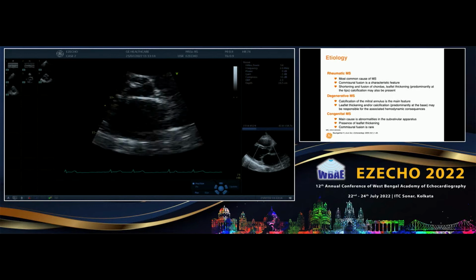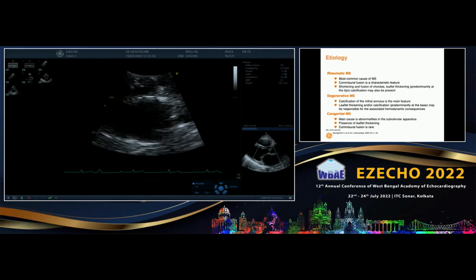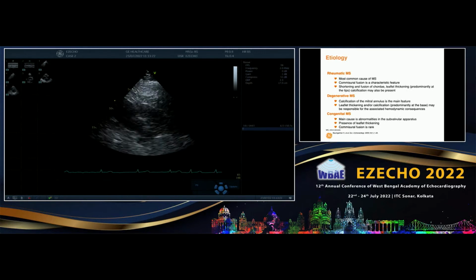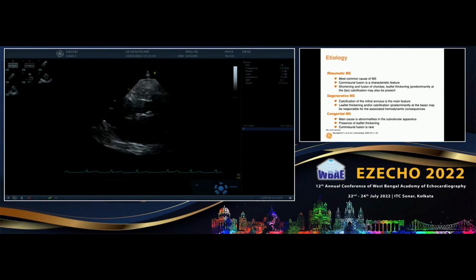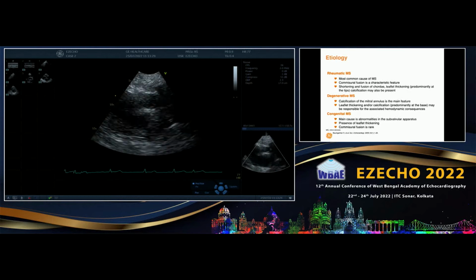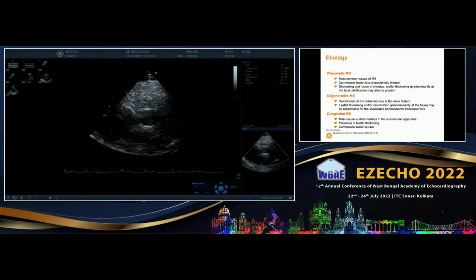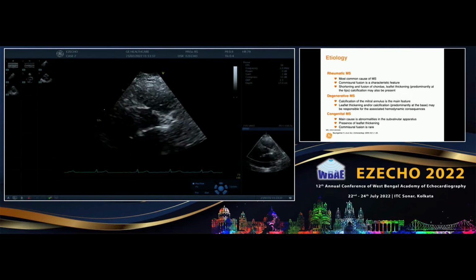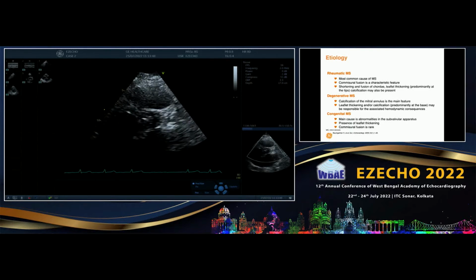Then I will look at the aortic valve a little more carefully. So let me see the long axis view of the aortic valve, zoomed one, and the short axis also, you can zoom, just zoom the valve so that I know the mechanism, whether I'm going to expect a severe AS or AR or something like that. So in a short axis view, let us look at the leaflets. Looking at the leaflets, I think there is a central non-coaptation zone. So probably I may get some AR there. I doubt whether there is a significant AS because there is not much hypertrophy of the LV and the leaflets are separating. So all this information you keep in mind.